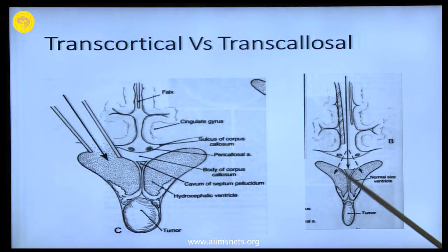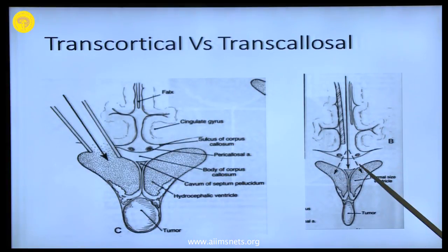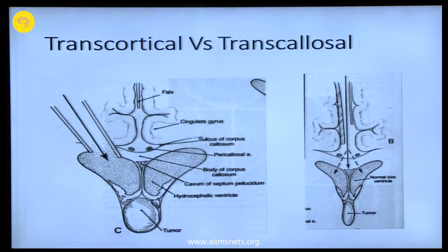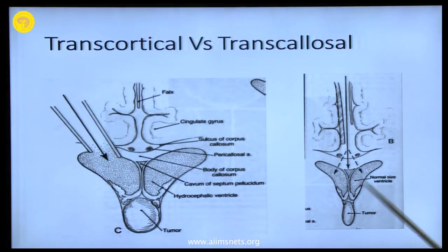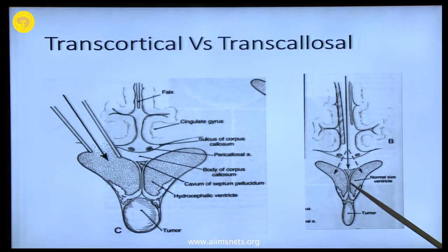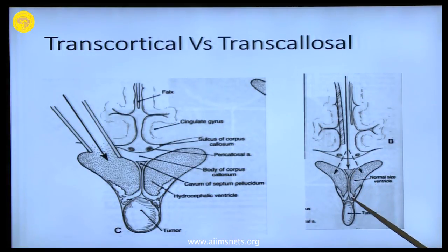You can enter here or here or here. Sometimes you cannot decide after you enter — you will then try to decide which side you have entered. The choroid plexus and thalamostriate veins help you. Ideally, once in a while out of four or five times, you will enter into the midline and see such beautiful anatomy.